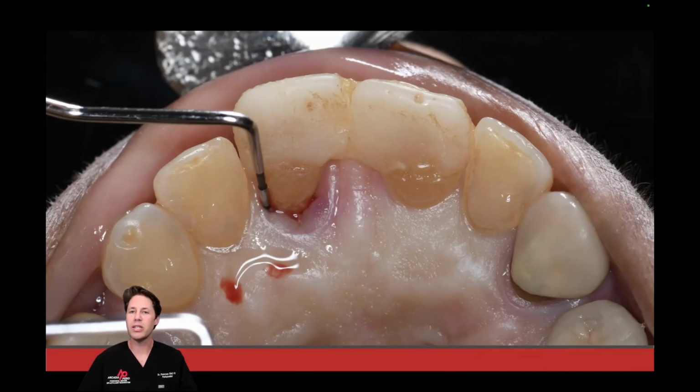It is absorbed into infected and inflamed tissues. So if we do SRPs and we remove the gingival inflammation, the laser will not target the tissues as well. The laser wants inflammation. The laser wants infection. The laser will work better when these conditions are such.